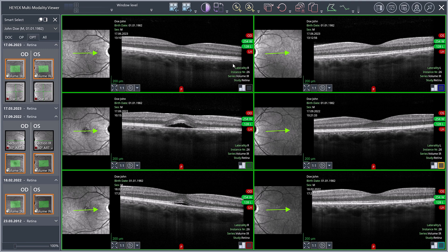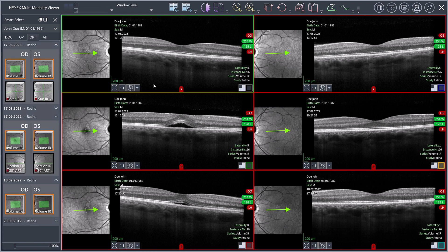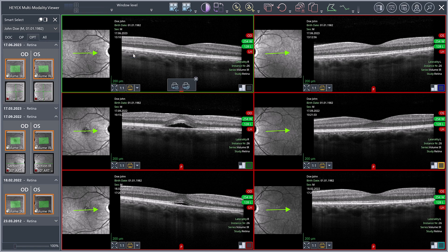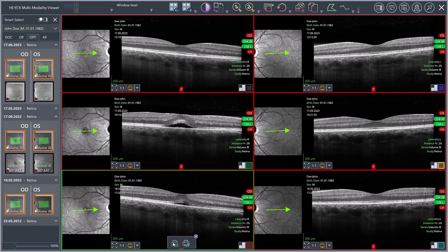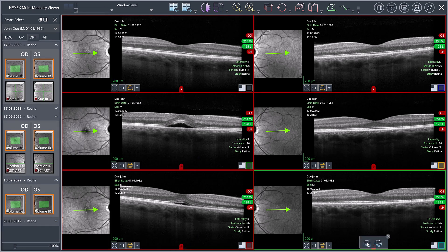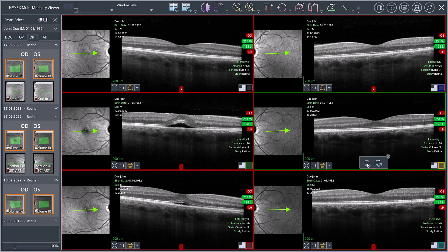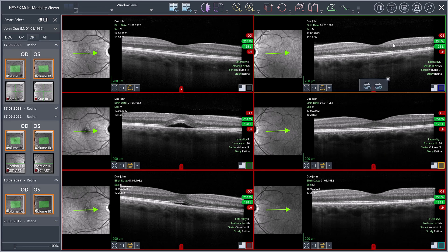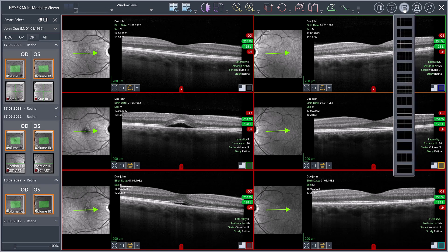You also have the option of printing a selection of the images displayed in the Multi-Modality Viewer. Click the small arrow in the quick access toolbar of any viewport and select Print to activate the print tool. Hover the mouse pointer over the viewport containing images to be included in the printout and click the printer button on the left. Click the print layout button in the ribbon bar to select the appropriate print layout.